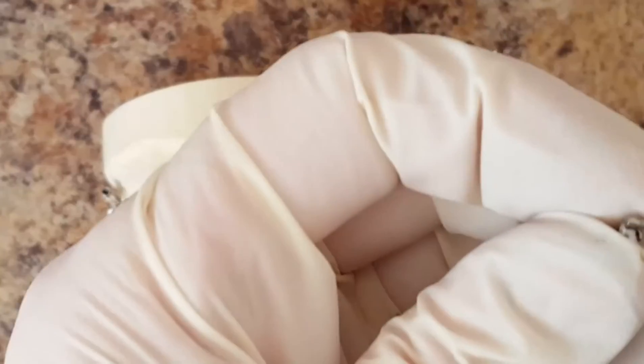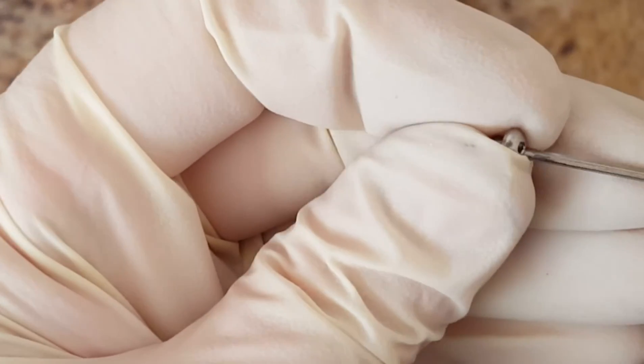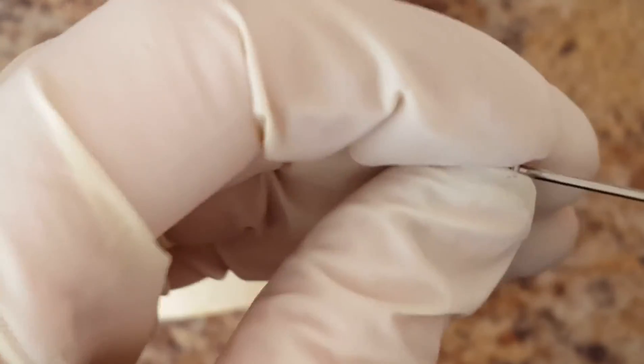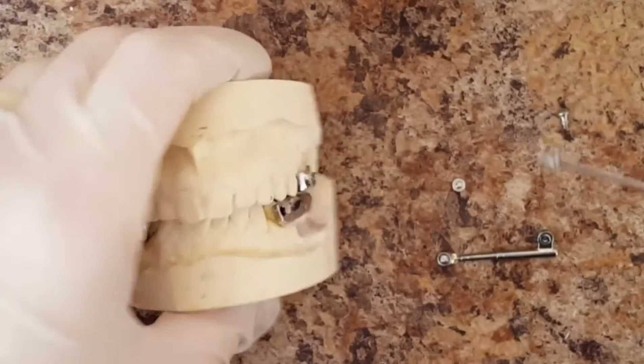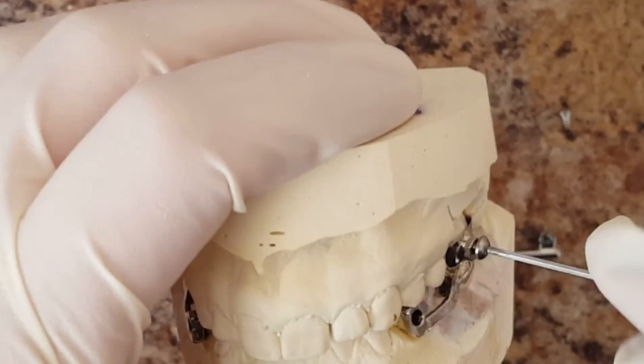In this next part of the video, I'm going to demonstrate how you would take an Allen wrench and hook up your hex head screw and place it in the child's mouth as you assemble the Herbst.